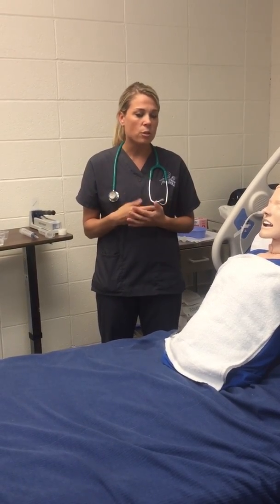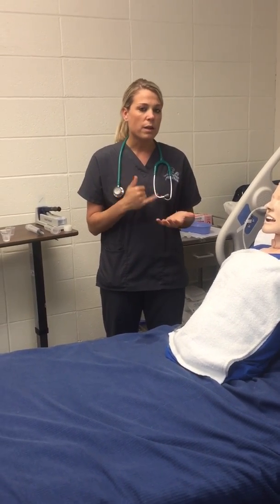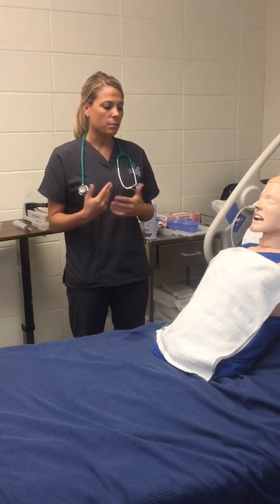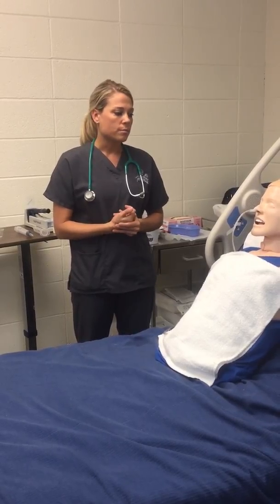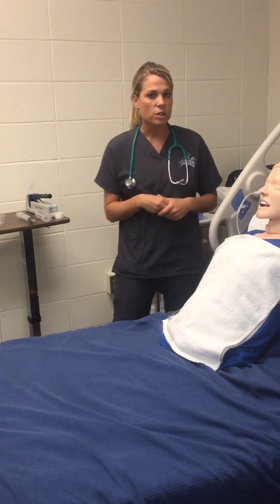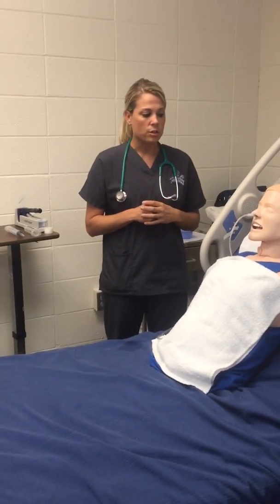Once getting into my patient's room, I would introduce myself. I would identify the patient with 2 patient identifiers. I would explain what medications he's getting, why he's getting these medications, and let them know how they're going to be administered through the NG tube. So then I would wash my hands. I would provide privacy for the patient and make sure that he is in the high Fowler's position before administering the medication.